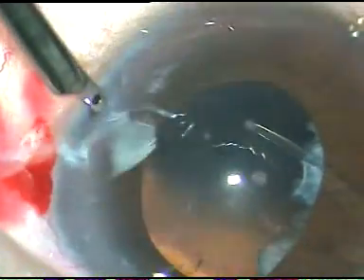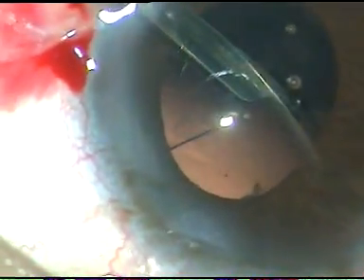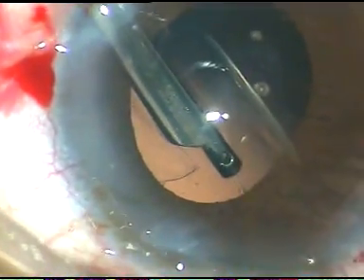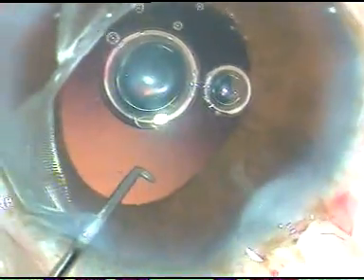Now I go through the side port at 4 o'clock and I remove the cortical matter which was there at 11 o'clock, 10 o'clock.